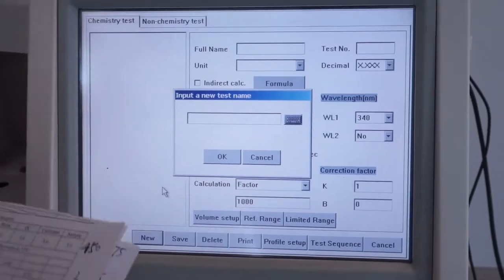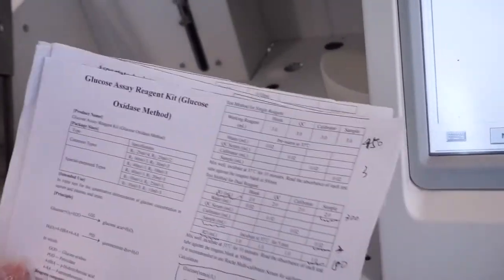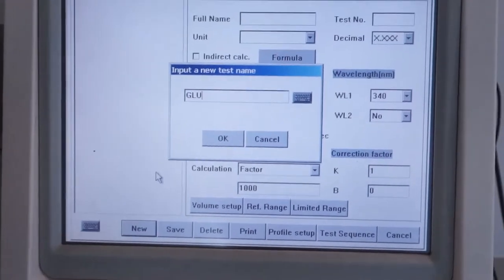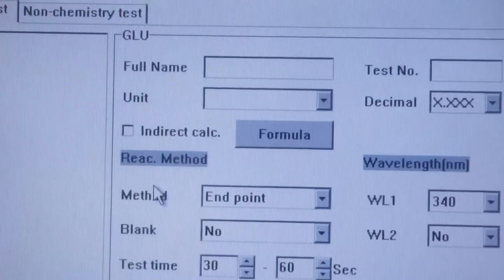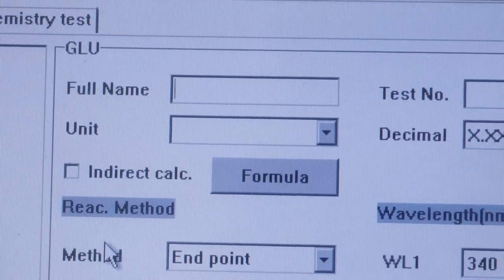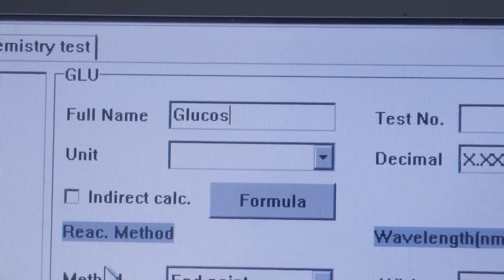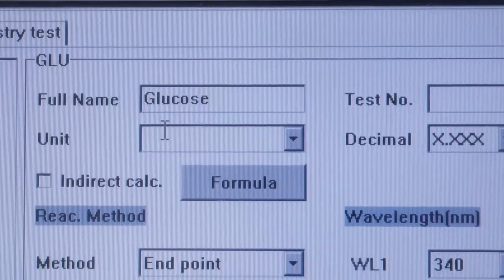And follow the number one instruction, which is glucose. Input the name, and then click OK. And the full name is glucose. In the unit, you can see the formula. The unit is showing here. Glucose unit.